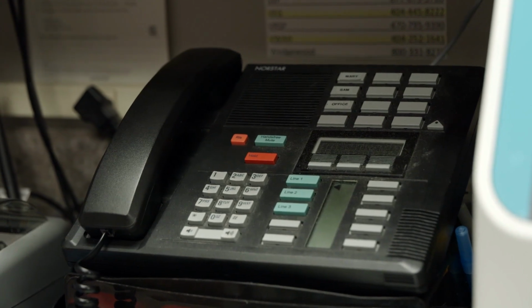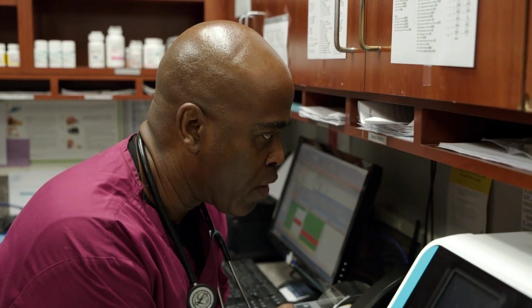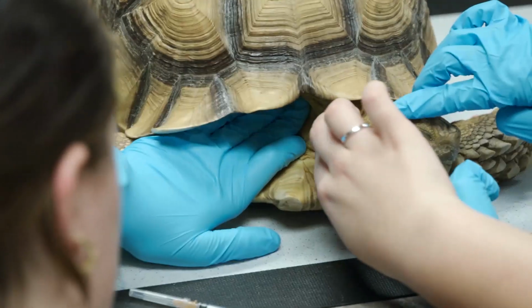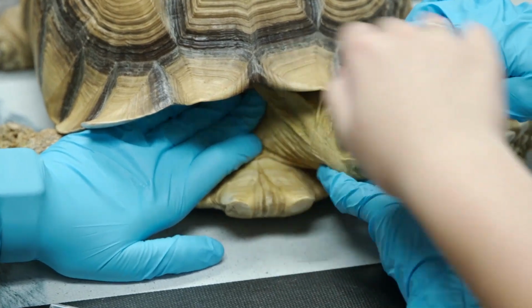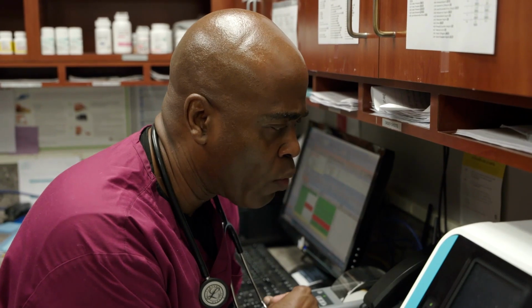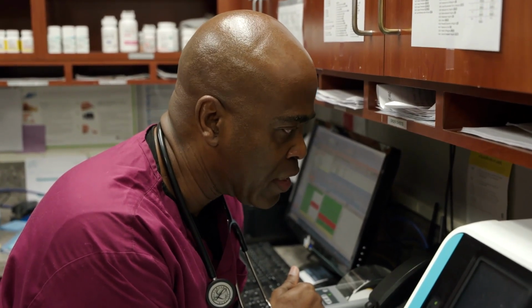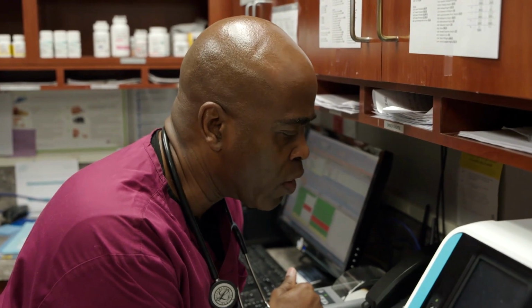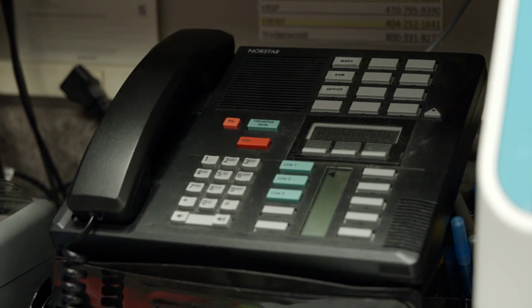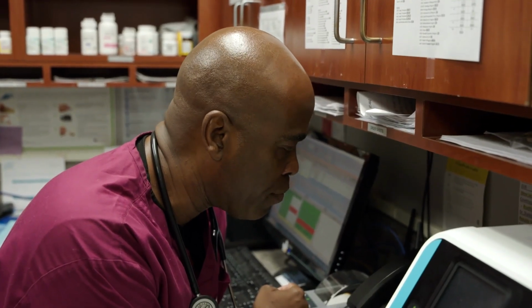Hello, Juliet. It's Dr. Edward. Hi, how are you? Hey, so we took the radiographs of Bedrock, and unfortunately, in her leg, and especially in her bones, there definitely looks like there's some inflammation and infection that's kind of eating away at the bone. You can definitely see some bone loss and some areas where it looks like there's some moth-eaten appearances. So, unfortunately, it looks like we're gonna have to amputate.